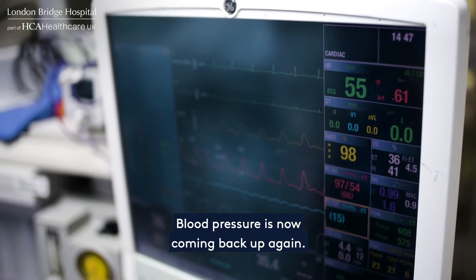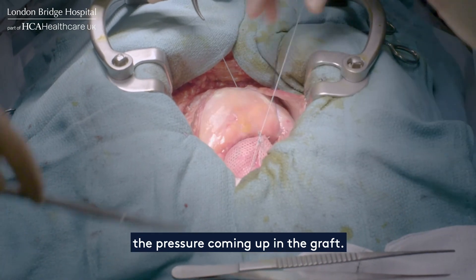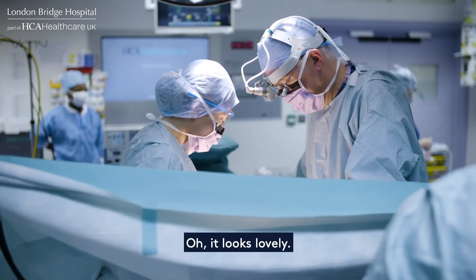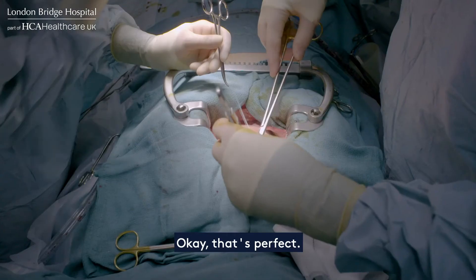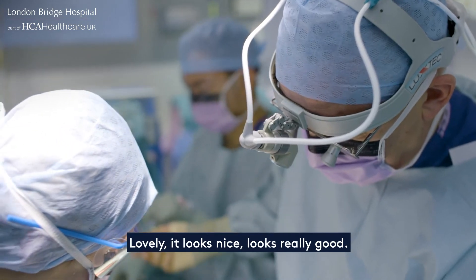Blood pressure is now coming back up again. The graft has been implanted. I can feel already the pressure coming up in the graft — it's now starting to look a bit tight on the aorta. A little bit — well, that's perfect. We're all happy with that. Looks really good.